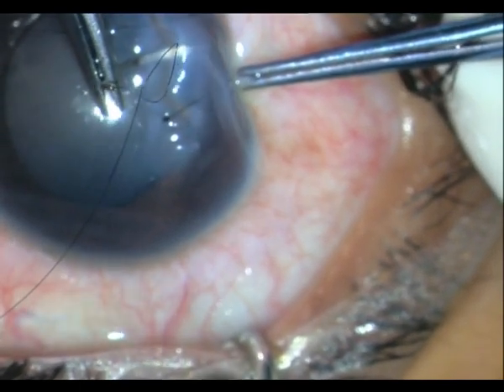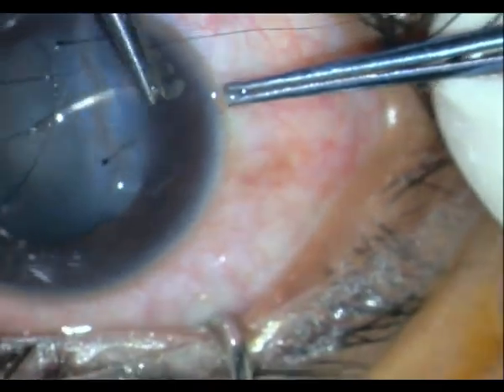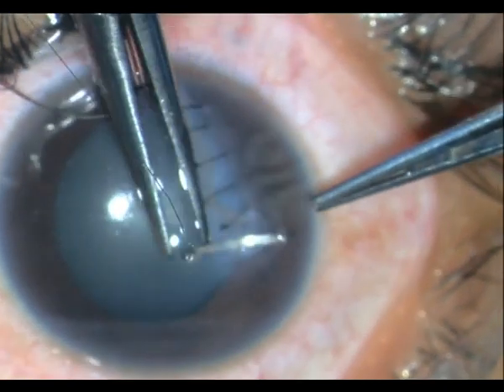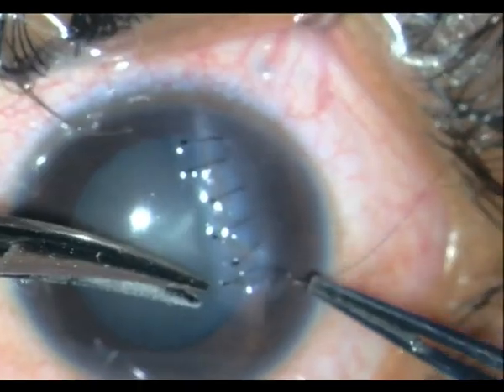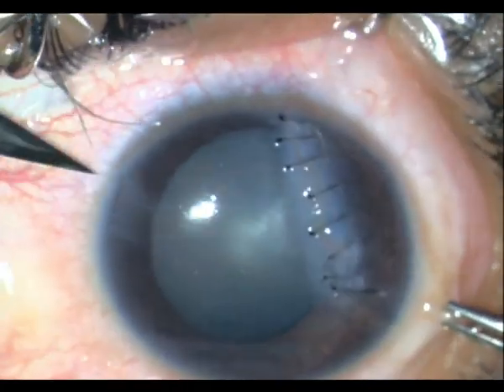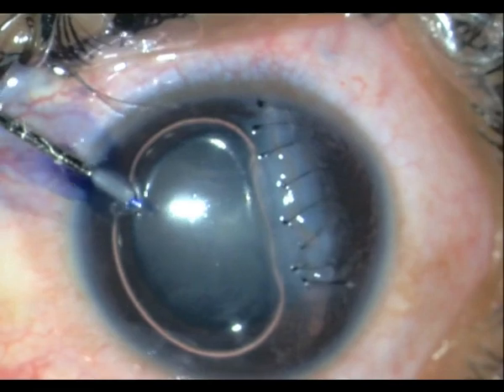As you suture, try your best not to lose the chamber and suture as atraumatically as possible. Once done, I go ahead and place a paracentesis wound and stain the capsule.